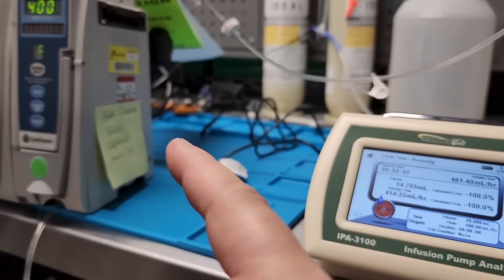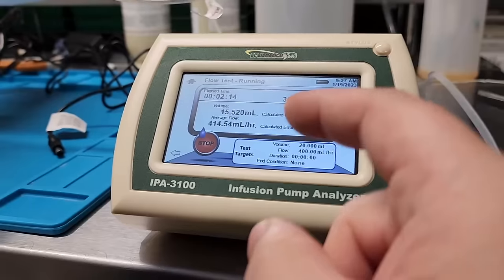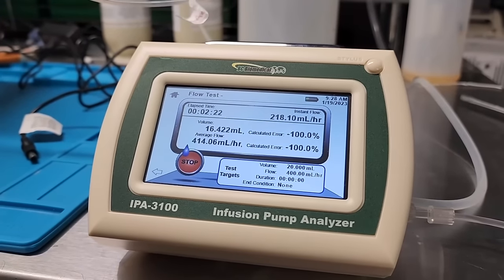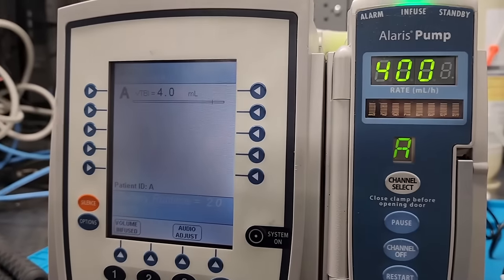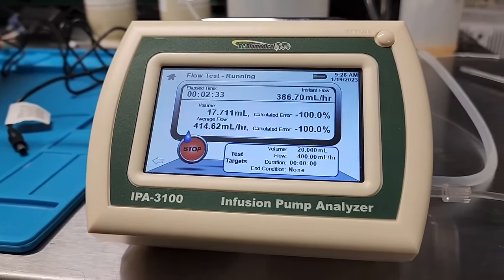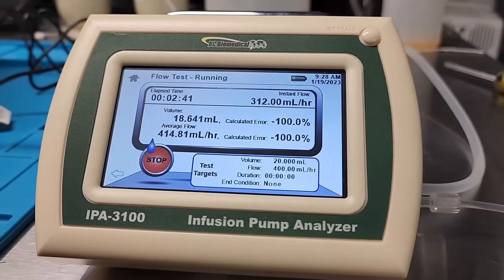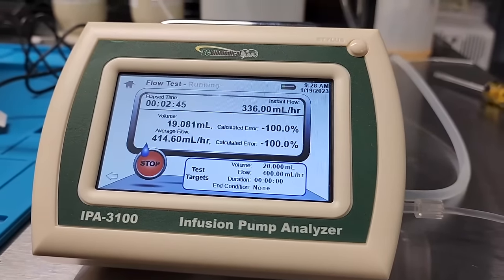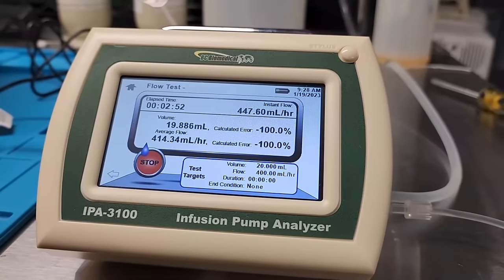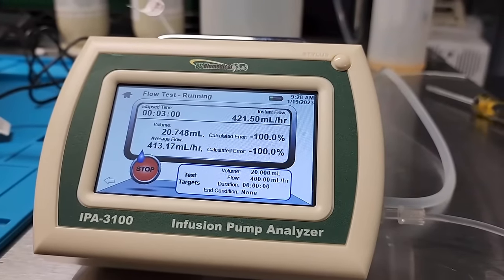And on these Alaris, remember that it has the KVO, keep vein open function. So after it's done with the infusion, you'll see that these numbers will quickly degrade, because it's no longer infusing at that correct rate. So your average flow right there, that's going to change real quick here as soon as it finishes up. And let's see, we have 3 and a half. You can see right there I was at 17 and a half milliliters. So it's going to be pretty accurate. Let's see what are our readings when it beeps saying it's done. We're getting close. We're at 414 milliliters per hour, that's pretty accurate. And there we go, 20.7.